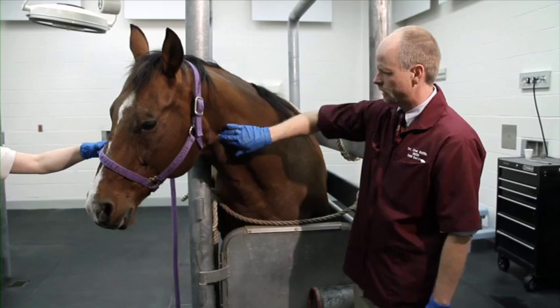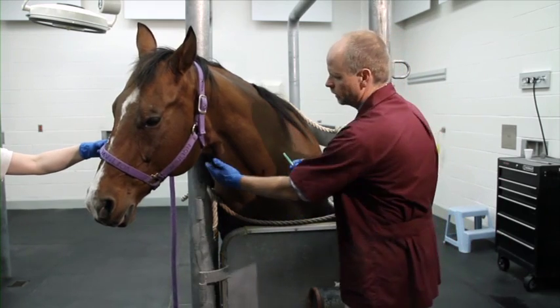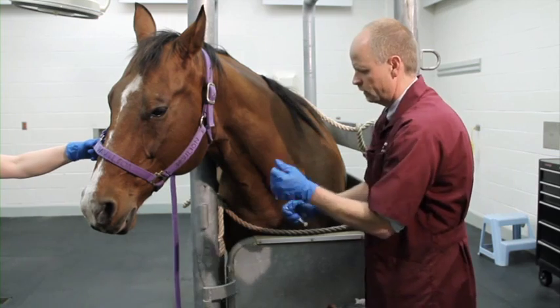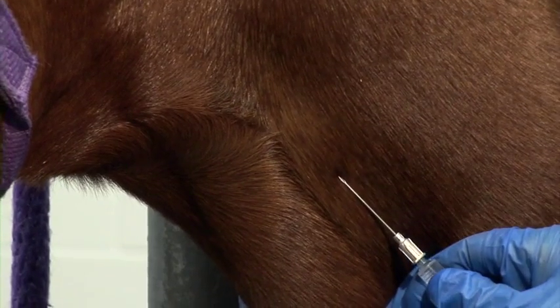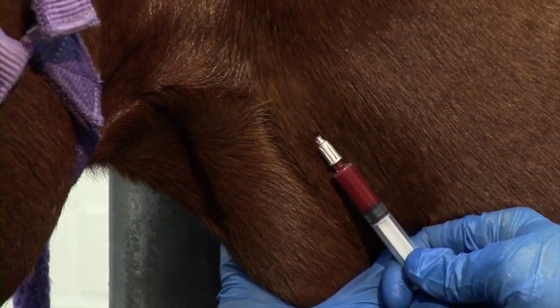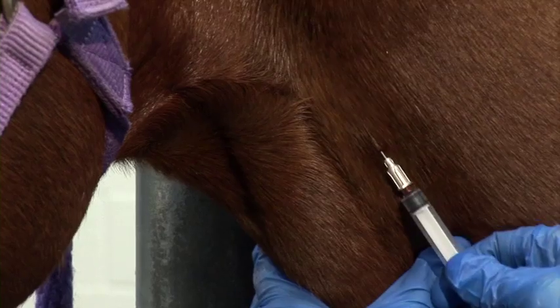To administer the intravenous injection properly, the veterinarian should first wipe the skin with alcohol. Aggie weighs about 1,350 pounds, so we've calculated the proper dose of xylazine to administer. We'll occlude the vein, visualize it just under the skin, and give the injection. Once the needle is in the vein, we can verify this because blood will come back into the syringe. We know we're using proper technique and not in the artery. In about two to three minutes, Aggie will be very sedate and tranquil.